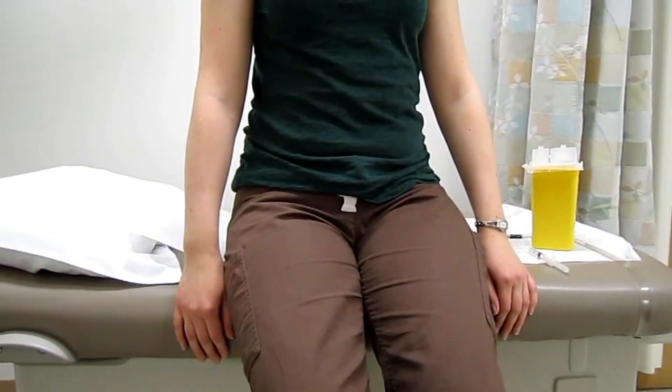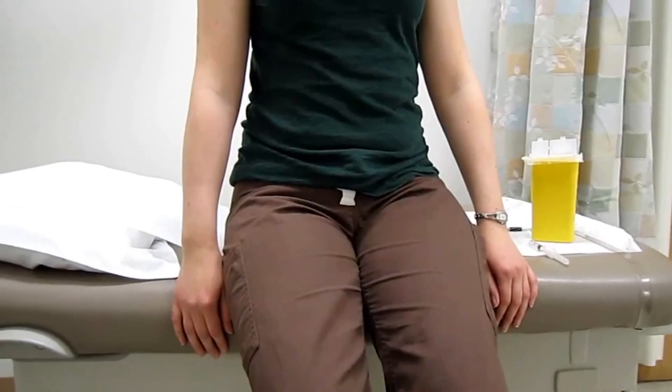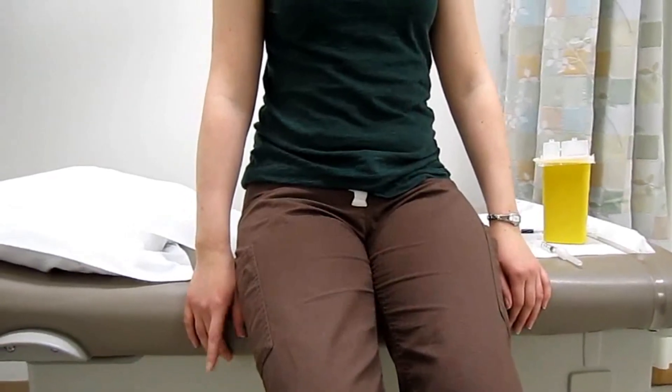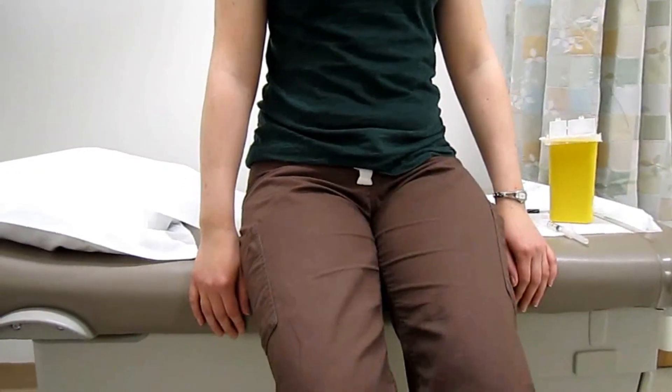We're going to choose and prepare our injection site. We're going to talk about landmarking. For methotrexate self-injection, the best sites are your abdomen and your thighs.